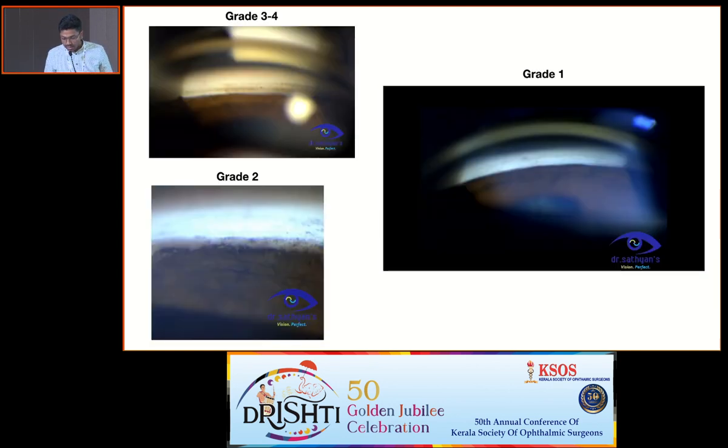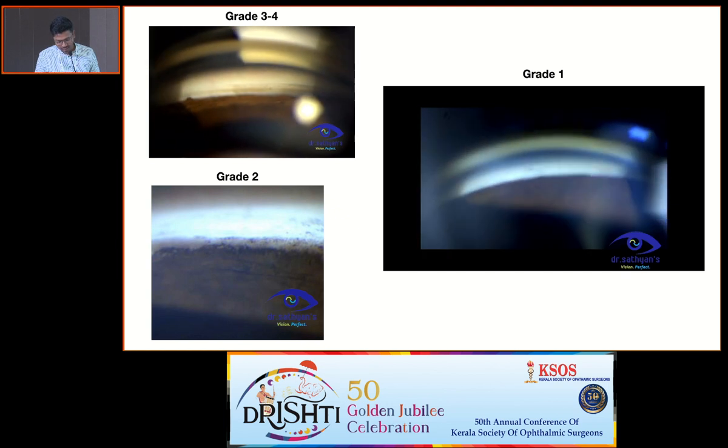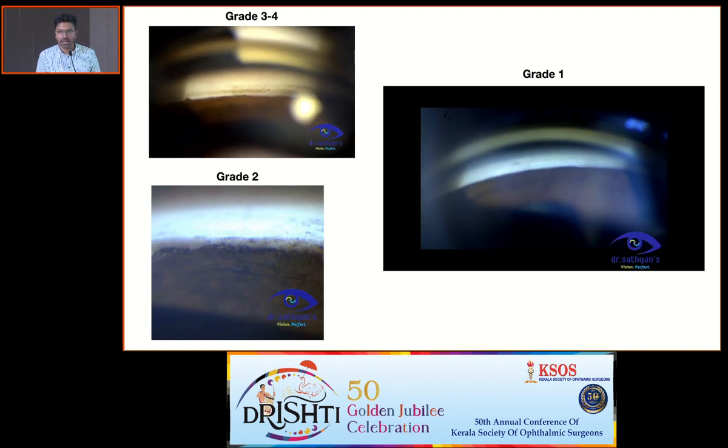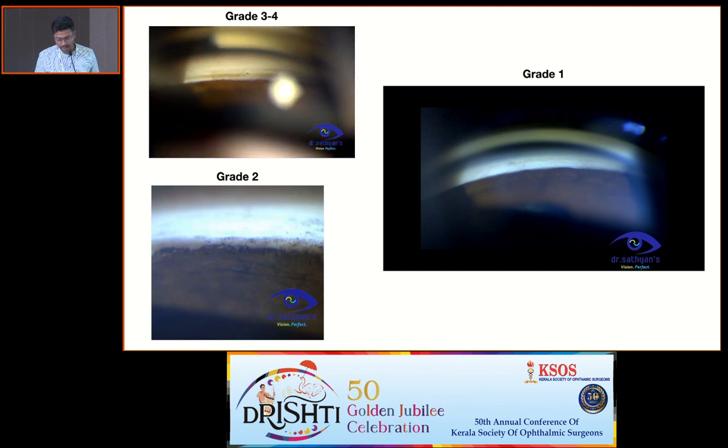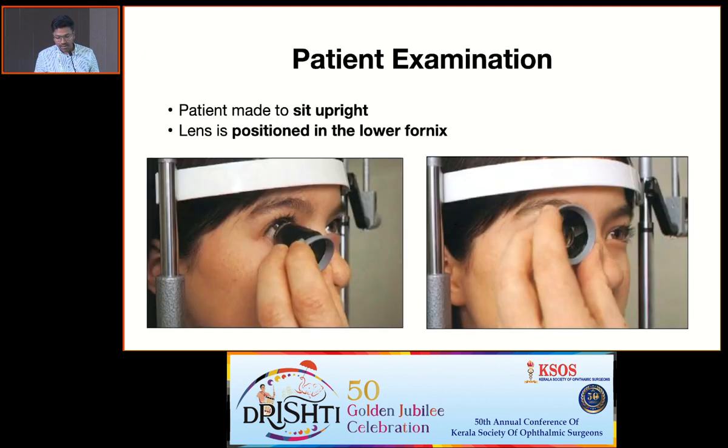So now the grading of angle structures is nicely demonstrated here, and this is grade 3 to 4, which is completely open, and grade 2 and grade 1 angle structures, which you can easily appreciate after the animated video. Whatever is there is a live image acquired from our center, from our patients, and we have documented it for learning purposes.